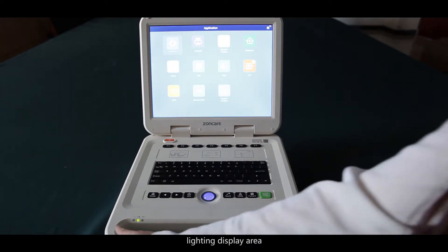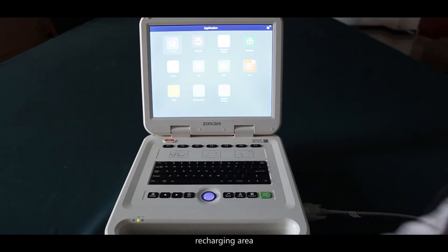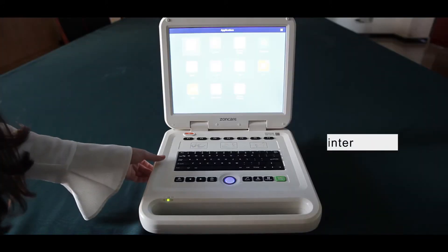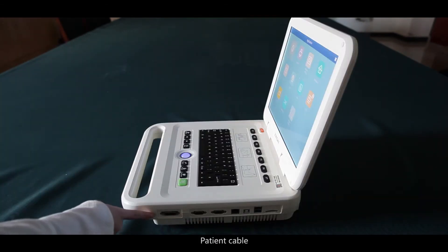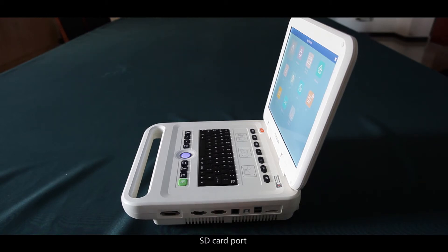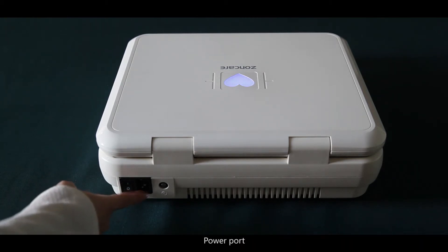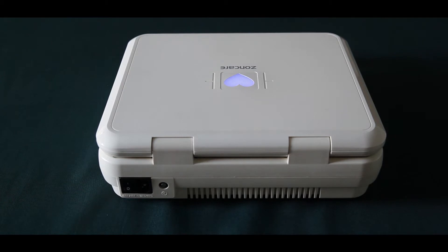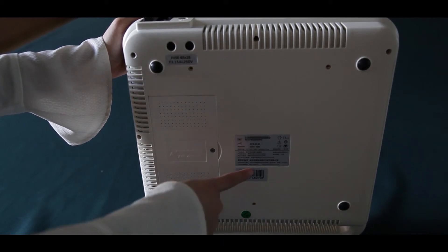Printing button. Lighting display area. AC display area. DC display area. Recharging area. Patient cable port. VGA port. RS232 port. LAN port. USB ports. SD card port. Recharging switch. Power port. Ground port. Battery area. Label area.